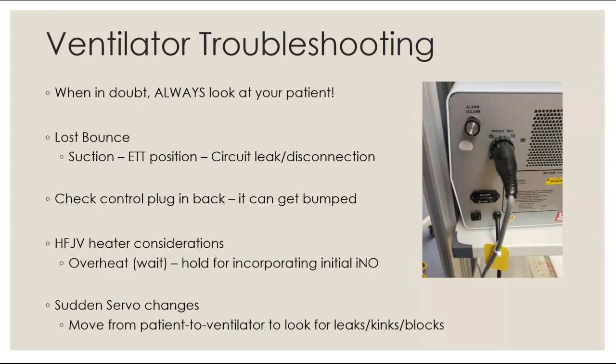Do I need to suction? A lot of the times they just have a big old booger they need out of their lungs. Do we have a circuit leak or a disconnection? What is causing this loss of bounce?